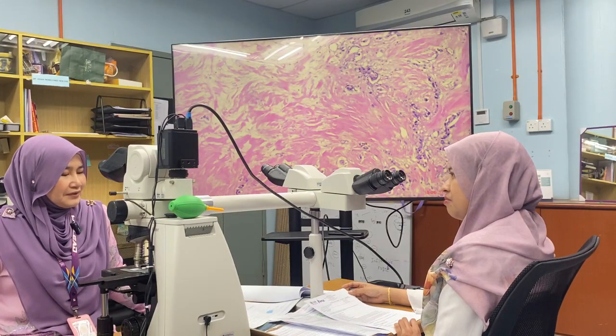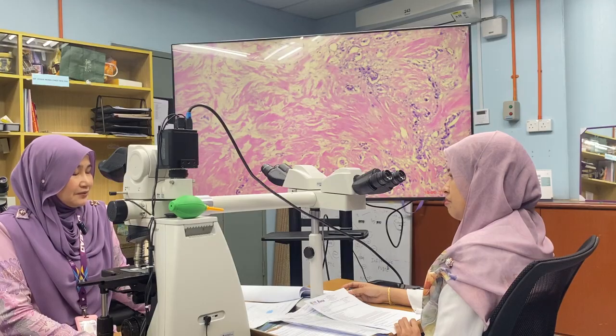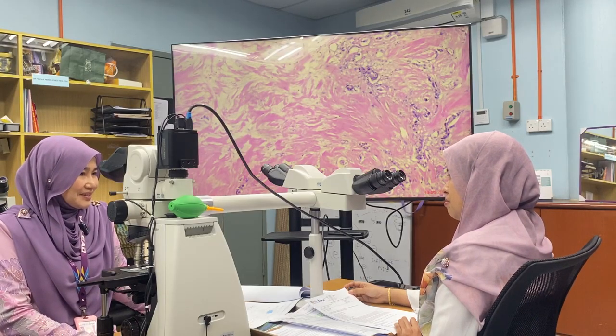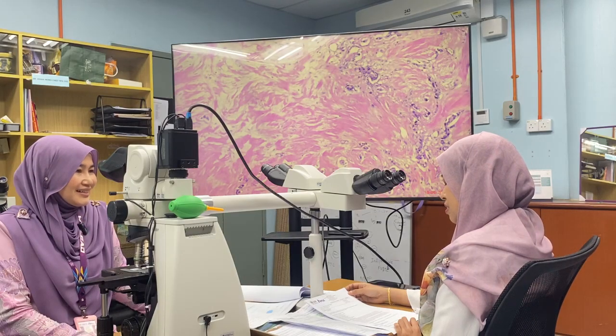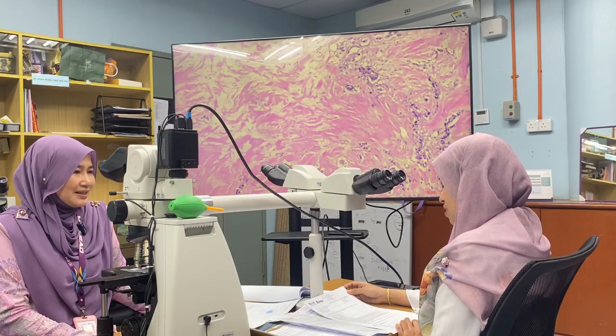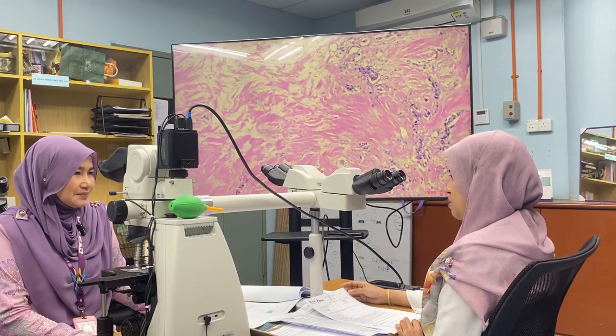But when we give positive or negative for HER2, we need to proceed with the scoring. I mean, what do you mean by negative here? Is it 0 or 1 plus? 2 plus? In this case, I think it's 0.